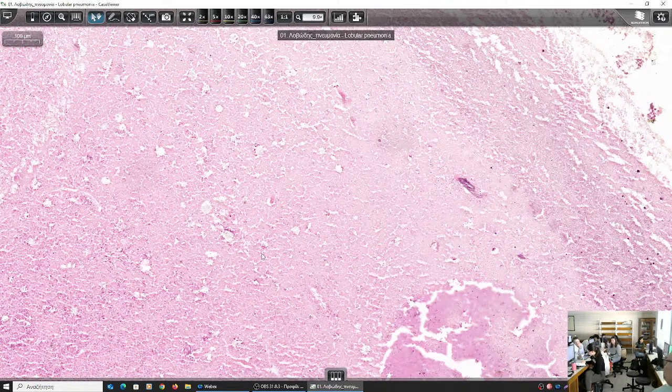What else can it do? If it destroys a lining covering epithelium, this is ulceration. And if it makes a way through the tissue so that it goes to a free cavity to fill, for example, here it crosses the lung and goes to the pleura, this is a fistula. Okay, fistula formation. These are the three consequences of pus formation.